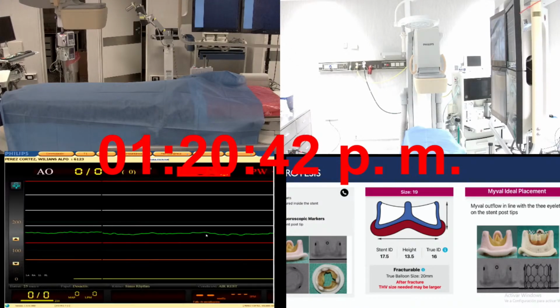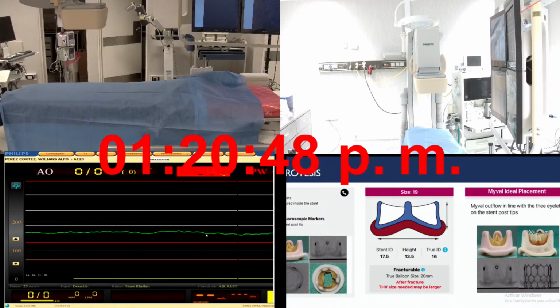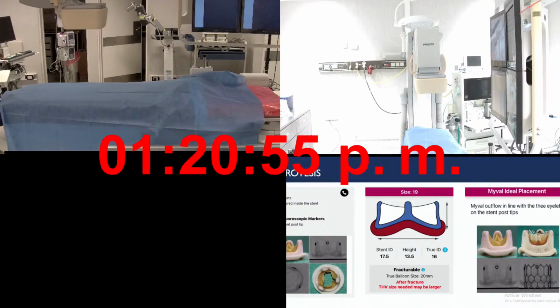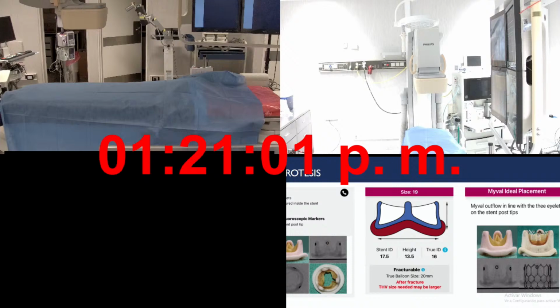I think that's the goal of the OCT study in part, to collect those clinical outcomes so we can eventually have, at the point of care, rapid evaluation of imaging parameters to guide treatment. That's particularly because it's probably not so simple as to say, if there's a TCFA, go ahead and put a stent. We probably have to look at more than simply one variable.